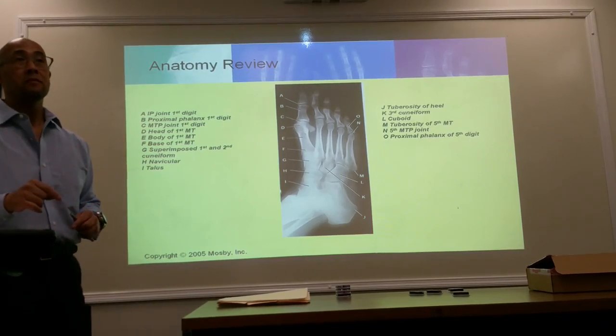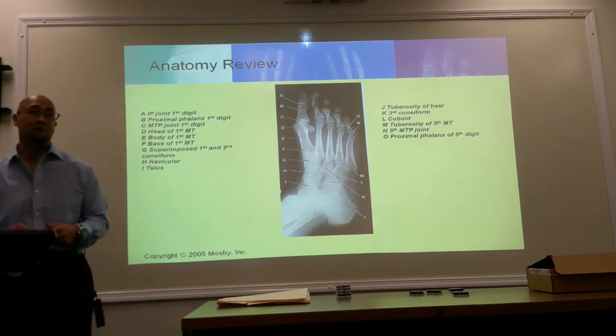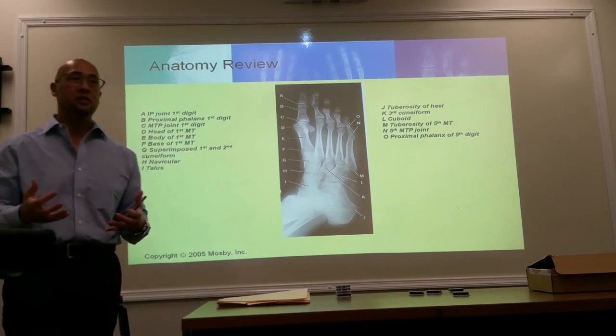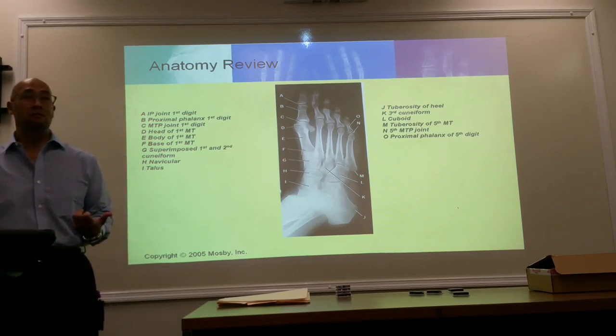Do you make them, like for ankles and stuff, do they need to remove pants or anything, right? They may or may not. It depends. If you've got those really tight skinny jeans now, where it's pasted onto your skin, you really need to pull those things up. If not, you're going to have to remove it. Okay.